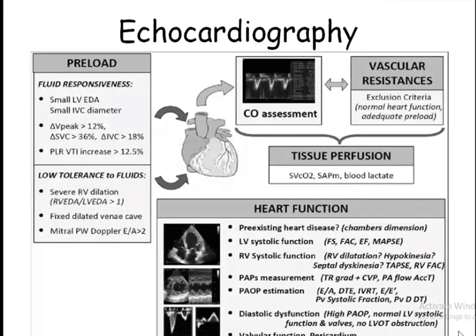By assessing the IVC, we can assess the preload of the heart, that is the volume status, whether the patient is in overload or in hypovolemia. Then you can easily assess the contractility, that is the pump of our body, so the cardiac status, whether there is LV dysfunction or RV dysfunction.